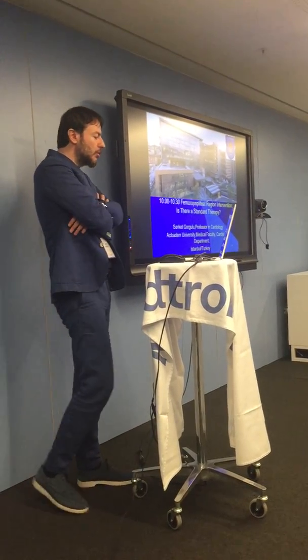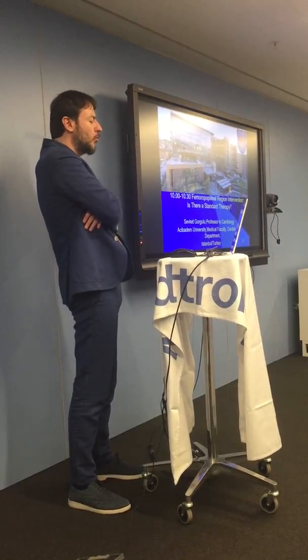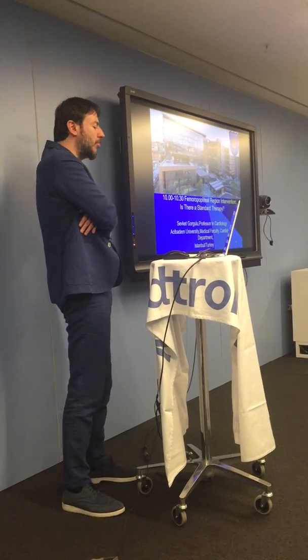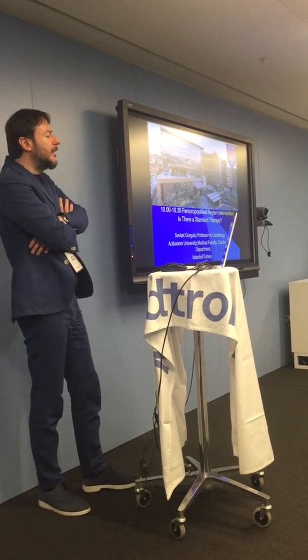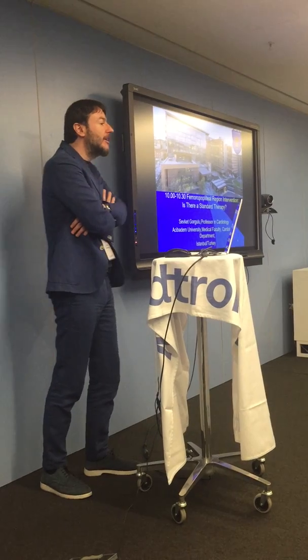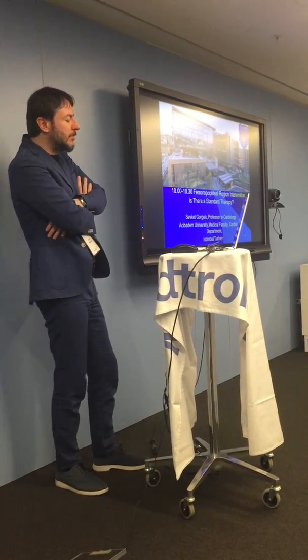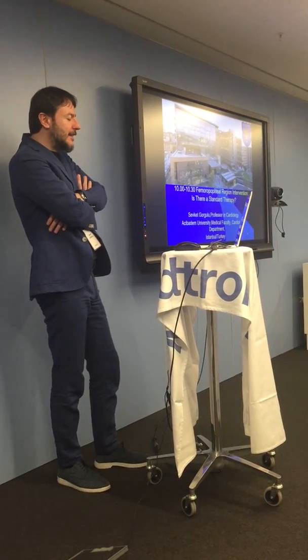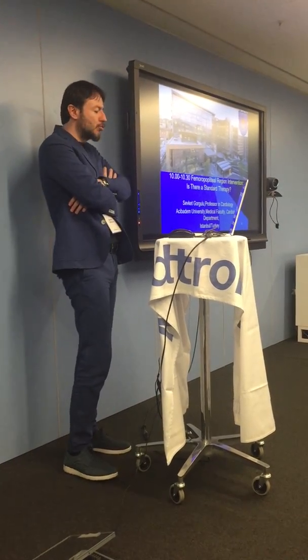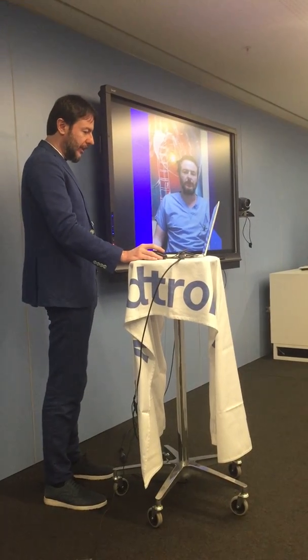I'm going to share with you the FEMPOP region intervention. I am one of those operators who advocate the endovascular first approach in FEMPOP lesions. The main problem in endovascular intervention of this region, as you know, is the restenosis and the reintervention rates. So our approach in FEMPOP intervention is to revascularize the limb with the most efficient techniques and stabilize the region with durable, long-lasting solutions. And we will also have a long talk about that.